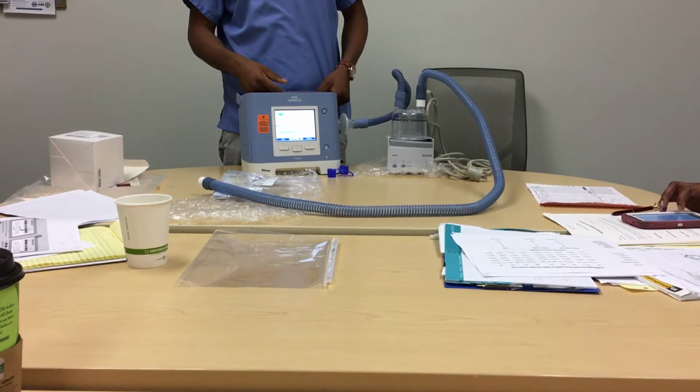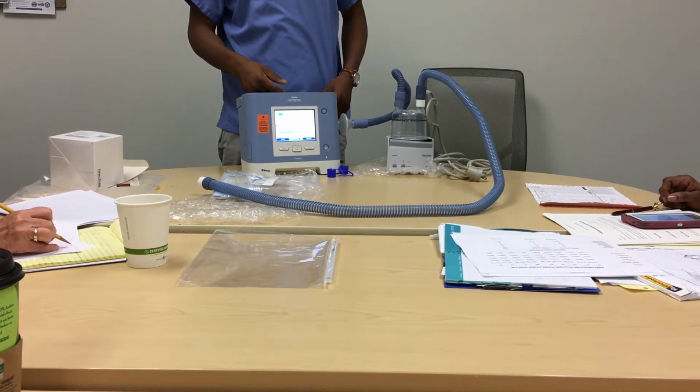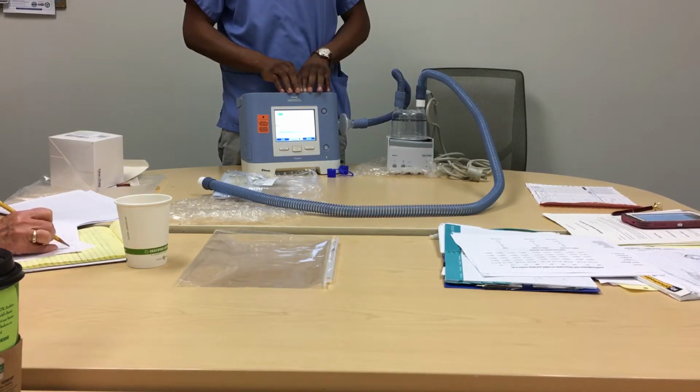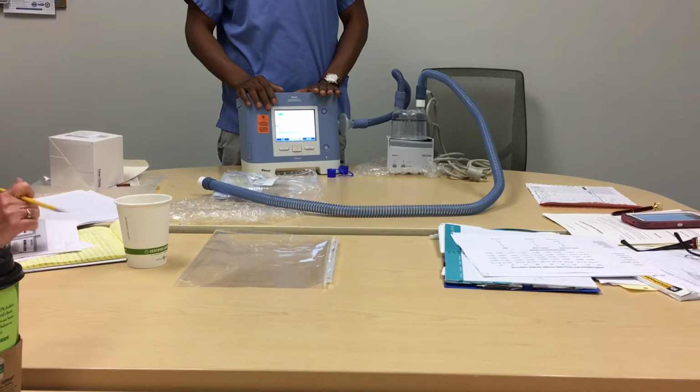Also, the patient I was dealing with, ASV was contraindicated because they had severe cardiac disease and a compromised cardiac output. Apparently there's a study out there that says no ASV with somebody with cardiac, especially with an ejection fraction of 30 or less. I haven't come across any other patient population yet. I'm supposed to be getting that study from Dr. Hickey, so I'll share it with everybody.